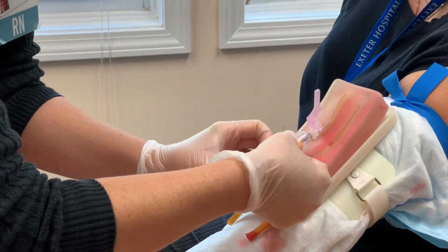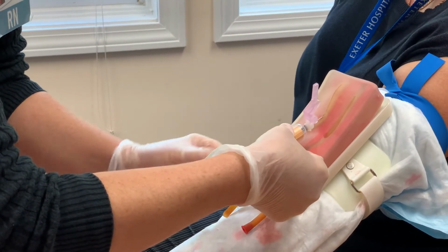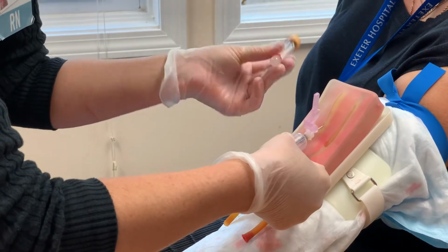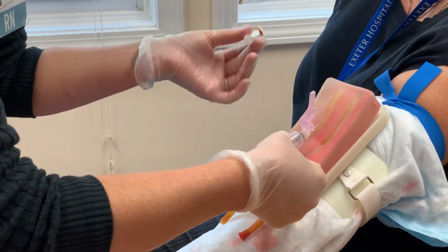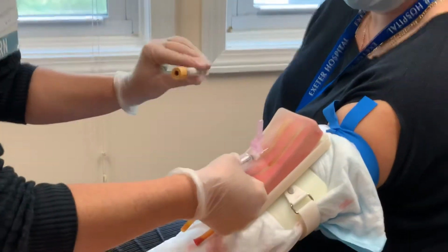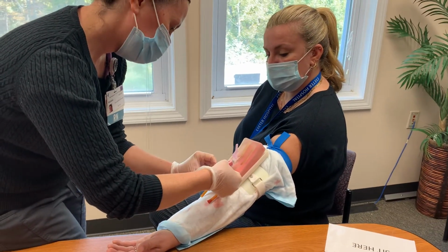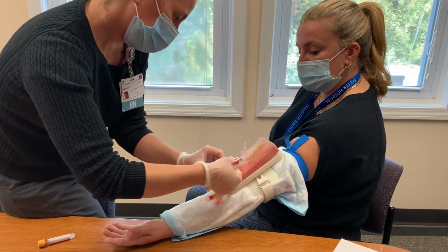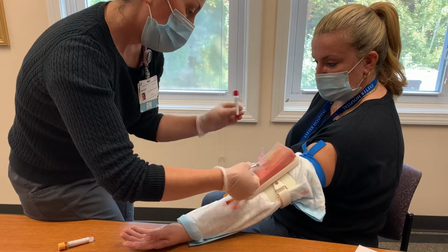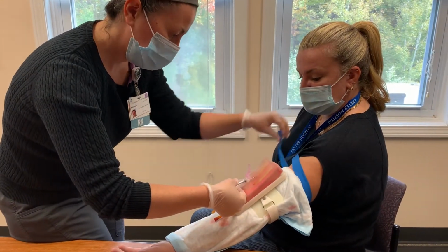You don't need to make a fist. Some people like to have a fist. That's not necessary. So I let the tube gather the blood. I've got to rotate it the number of times that it indicates on our forms in the working binder. So I'm keeping my right hand nice and stable. The needle's in. I'm moving around more with my left hand. All right, I'm releasing here.